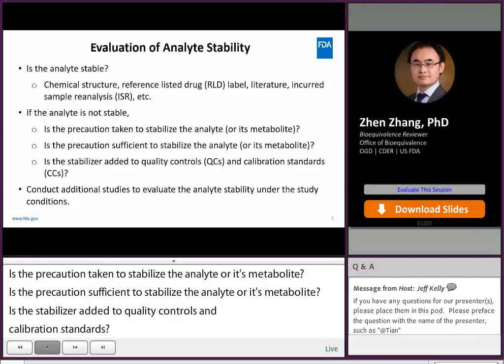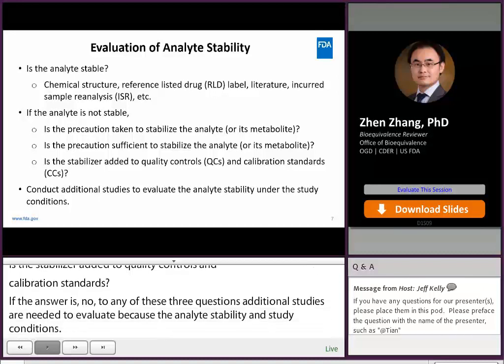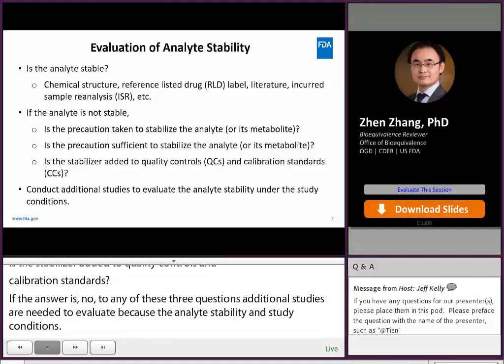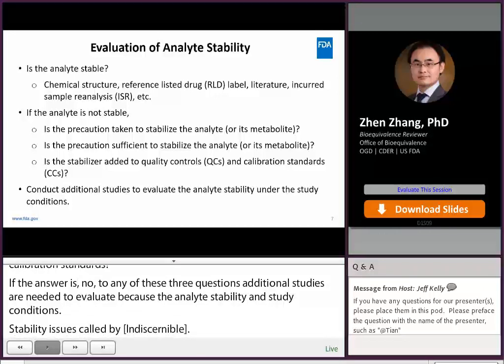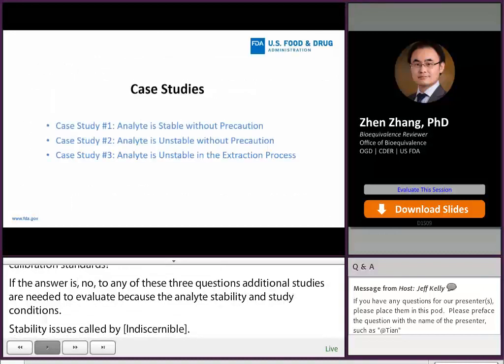For stability issues caused by back conversion, the most common supporting data are stability studies on the mixture of the analyte and its metabolite at different concentrations and study conditions. I will use three case studies to explain how to identify and resolve stability issues.